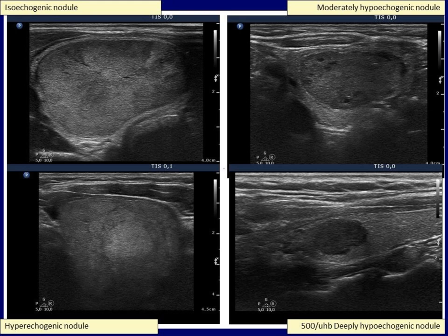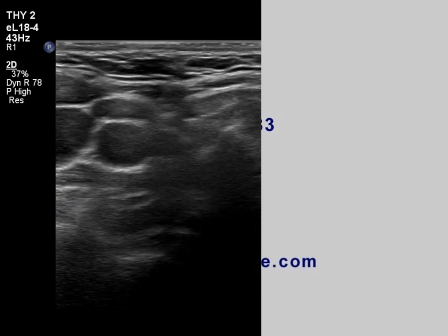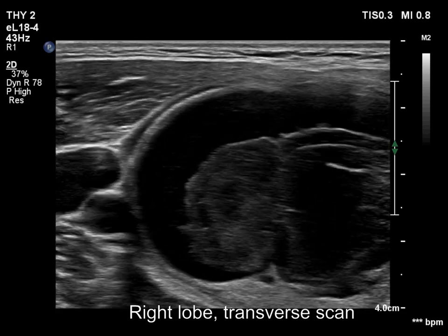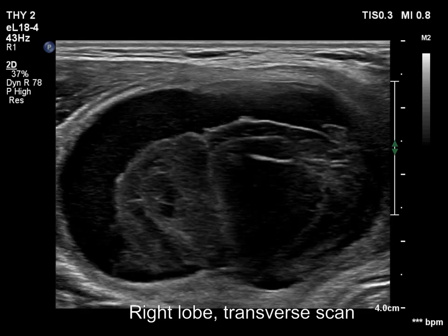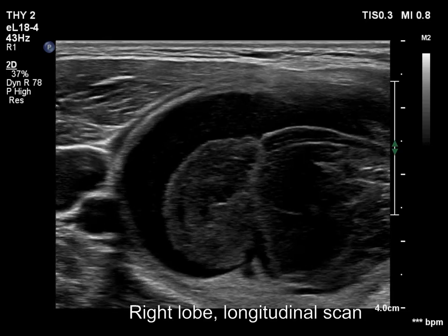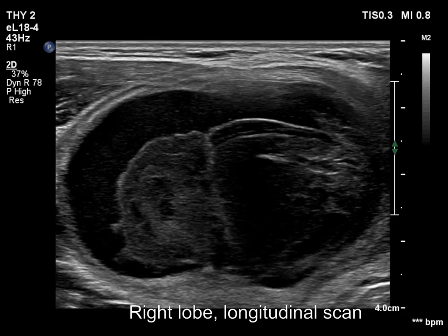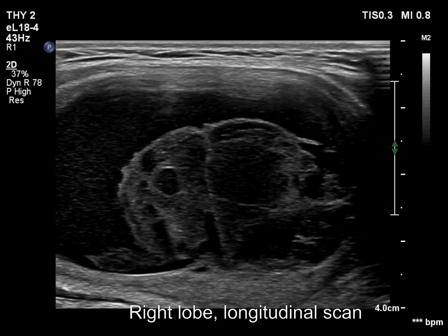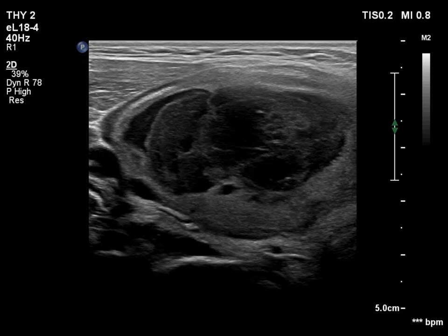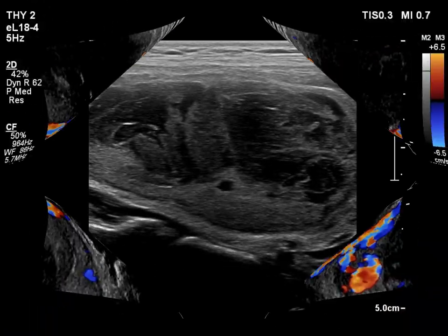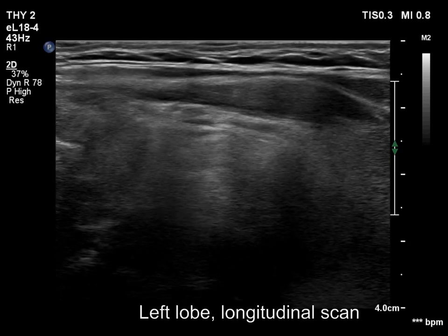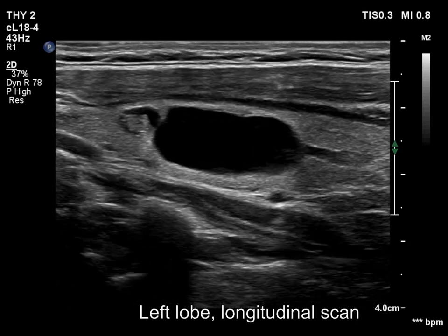Finally, I present the case. The right lobe has a large nodule. The cystic content clearly exceeds 50 percent but is less than 90 percent. A thin echonormal solid parenchyma runs all along the inner wall of the nodule. So this is a central type, predominantly cystic nodule. We had to reset the depth in order to visualize the dorsal part of the lobe. The cystic content of the largest nodule in the left lobe clearly exceeds 95 percent, so this is an almost completely cystic nodule.